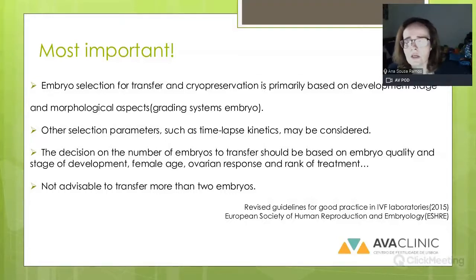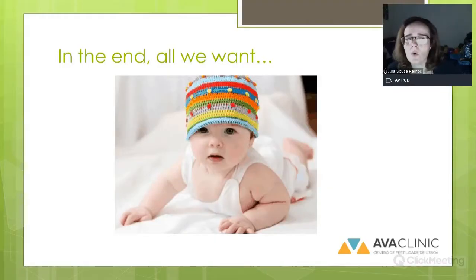And of course, as I think most of you may know, try to do single embryo transfer, only one embryo, okay? Do not put the woman at risk of having a multiple pregnancy. Sometimes people are trying treatments, but it's better to have a healthy pregnancy. And now with these grading systems, they let us choose the best embryo, or the embryo that has a high implantation rate, because in the end, what we all want is a healthy baby. Hope to get to you.